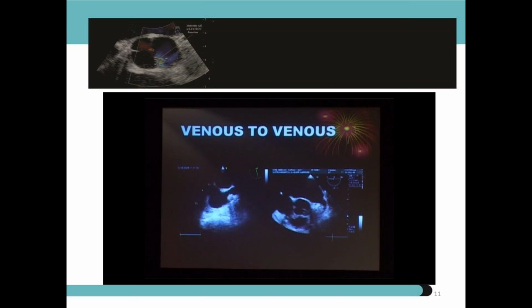So the IVC here, and if you rotate it slightly towards 90 degrees, you have the tricuspid valve here. So you rule out a TR, see the SVC, whether it's blocked, open. SVC blocked, the cannula in place in the mid. Where should the cannula be? The cannula should be in the mid RA or towards the SVC. It should not be here. It should not migrate here. It should not migrate upwards. So this is the best view. This is the bicaval view.